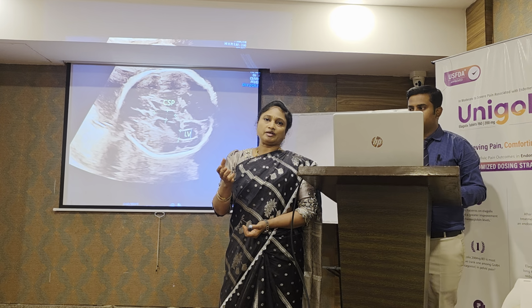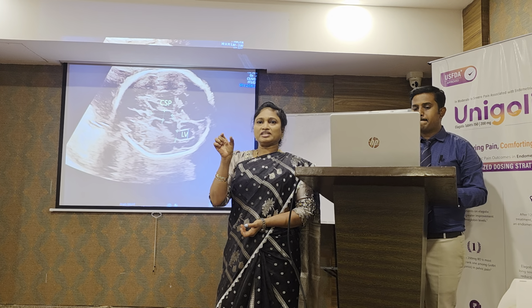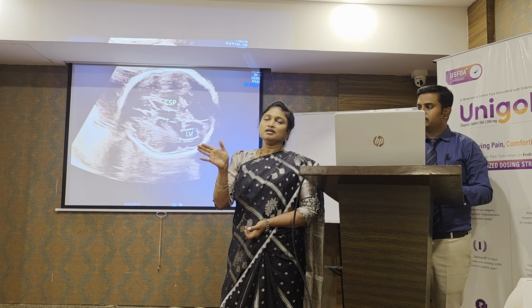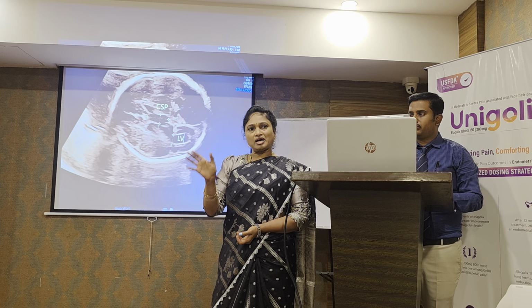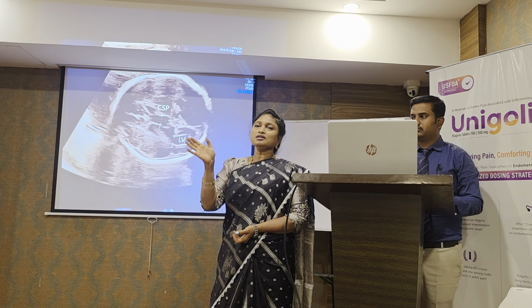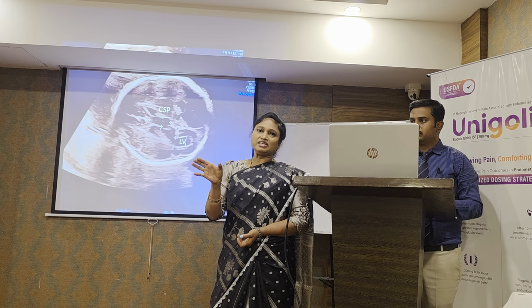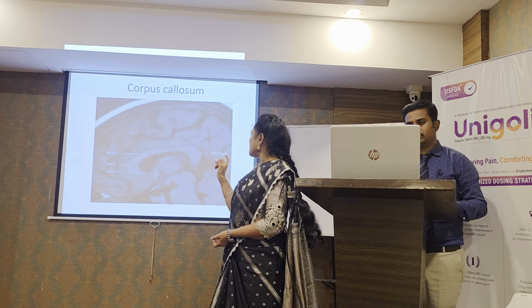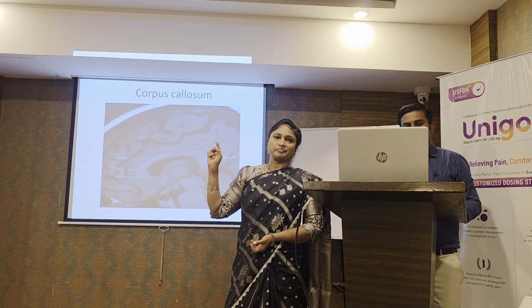What does it signify? If you see a very big one or a very small one, immediately go for the sagittal, mid-sagittal plane. Even otherwise, you have to map the mid-sagittal plane. That is the neurosonography of the fetus, because you have to see the next one. You have to see the corpus callosum.